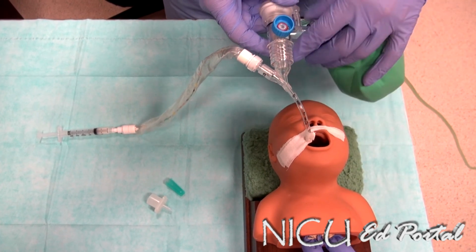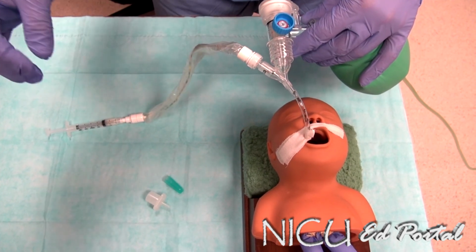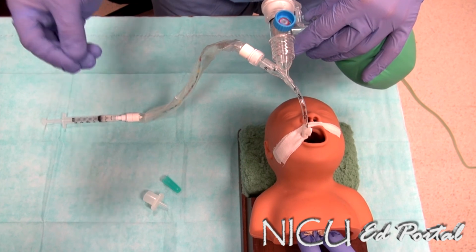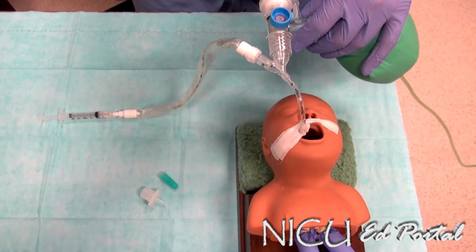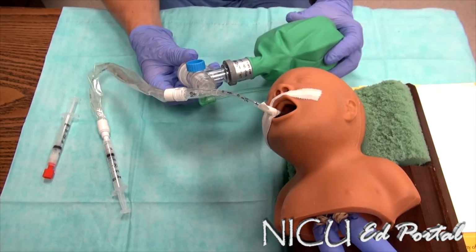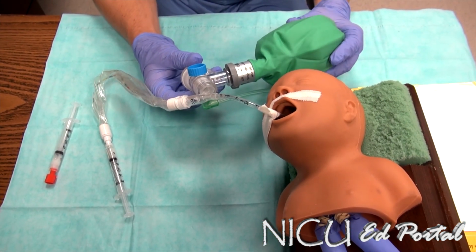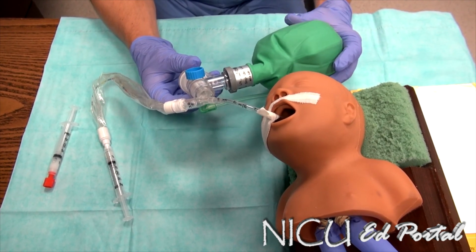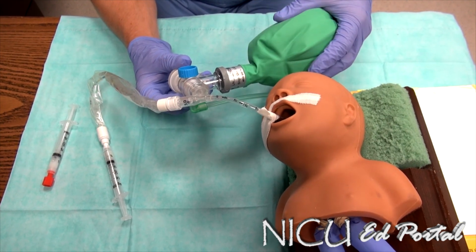That's the demonstration of inserting the catheter, and we can also demonstrate giving both aliquots, lifting the baby to the right and to the left. Okay, so here we have the baby lifted to the right side, on his right side or her right side. We are about to give the first aliquot.